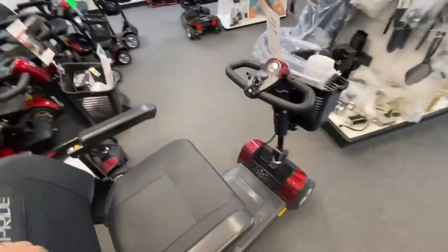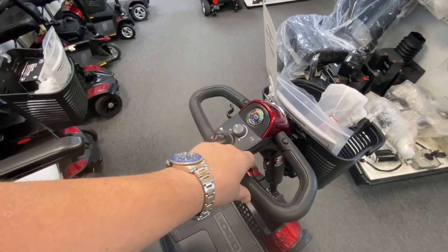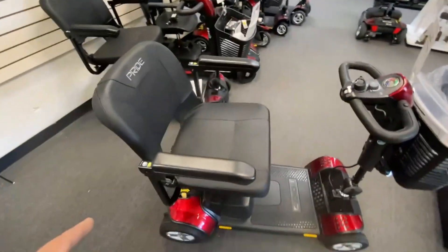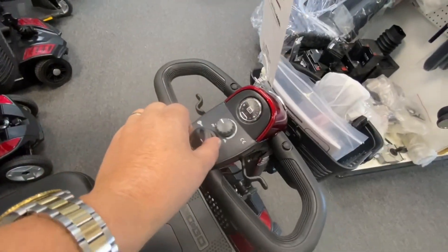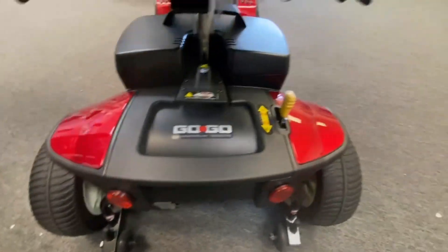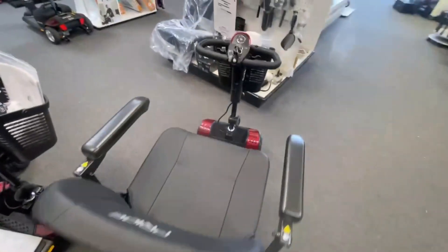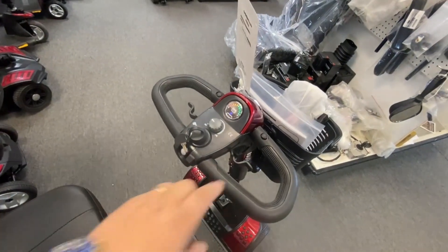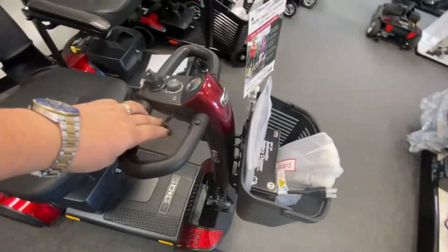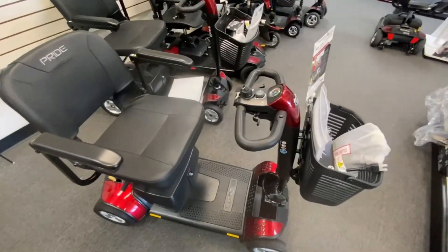When you turn the scooter on and it's in the neutral position, the scooter will not operate — it won't go anywhere. It needs to be in the drive position to drive. So basically what you would do: turn the scooter off, go to the back of the scooter, find where your brake handle is, pop it into drive, make sure it's locked into position, go back to your key, turn it back on, and everything is cleared. You can then move the scooter via the motor. It needs to be in drive to drive — it's as simple as that.